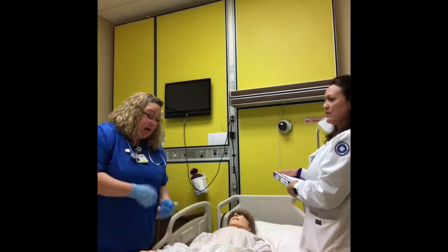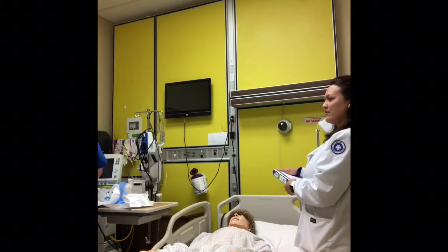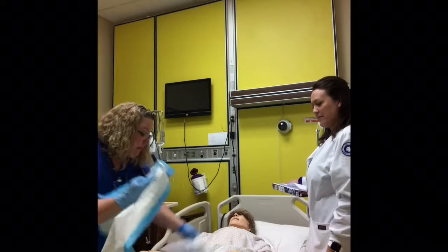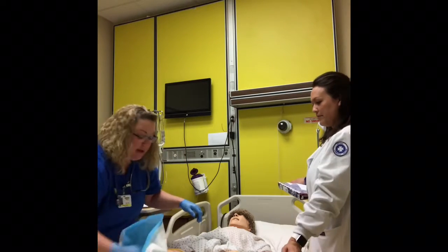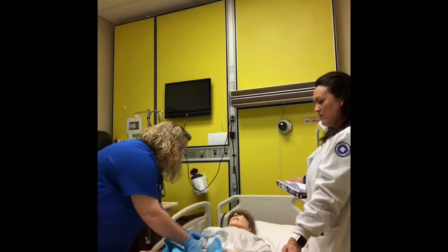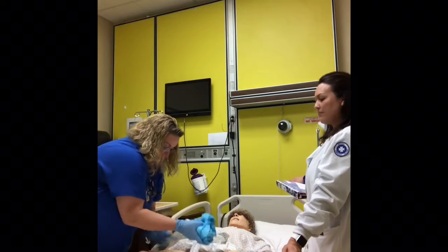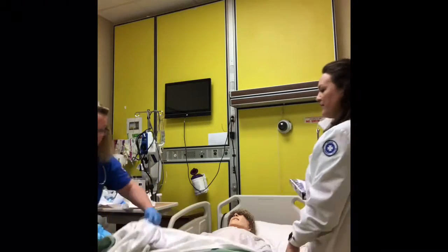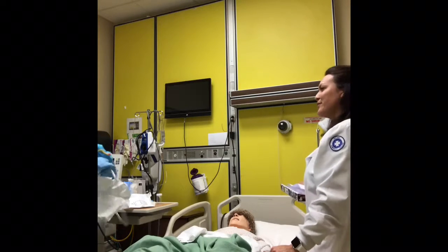So you take the water out, you have your chuck ready, and then you just wind it into the chuck. Make sure you don't flick urine on yourself. Make sure you've checked your orders. You've got your chucks there. And then you're going to just tell the patient to take a breath. And as you pull it out, you coil it in the chucks like that. And then you can throw the whole system away. And make sure your patient's comfortable, and that we check on them at least every hour or 2 hours just to make sure that they don't have a need to go to the bathroom.